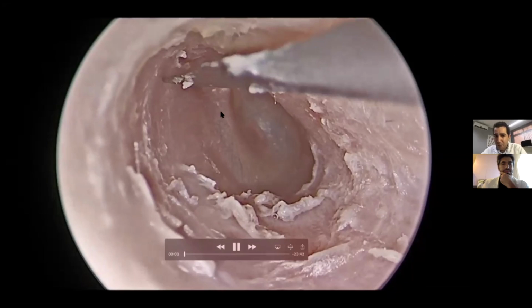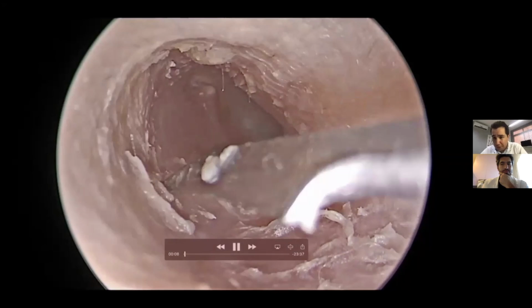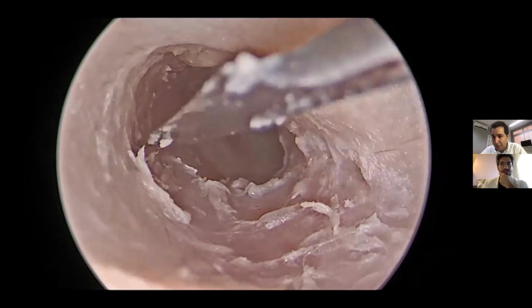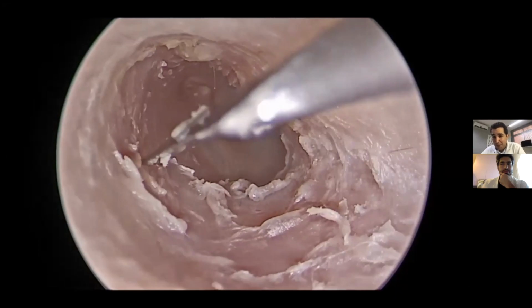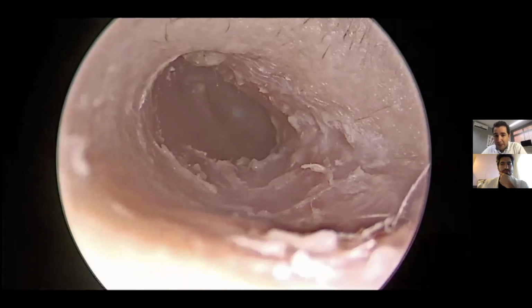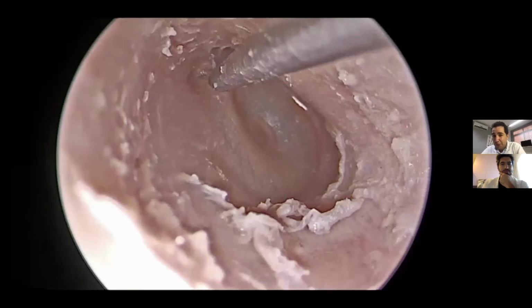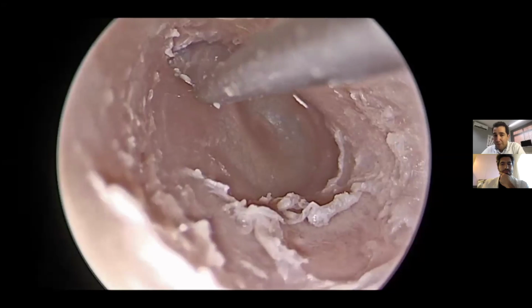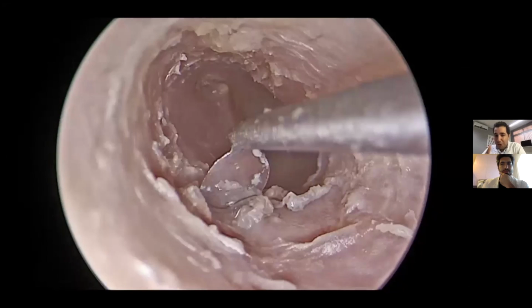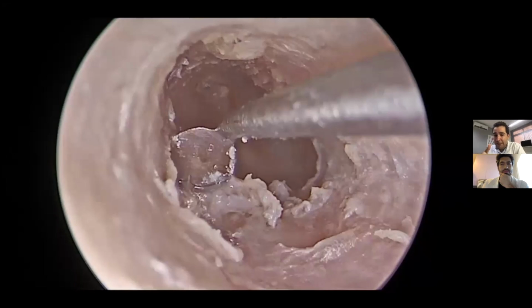So once again, we can do this marking of the incision with a knife. Of course, this should not be done in real life, because as you traumatize the external ear canal in a normal patient, it's going to bleed, and bleeding is a problem for us. So we use the rosin or the round knife, of course, to do the cuts. It's very important in dissection and in surgery to have a very good cutting instrument, because if you have a very sharp instrument, you won't need to pass the cut several times, and then you have a more clean cut and less bleeding, of course.